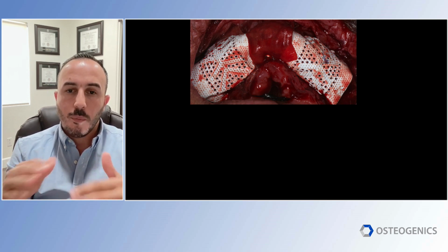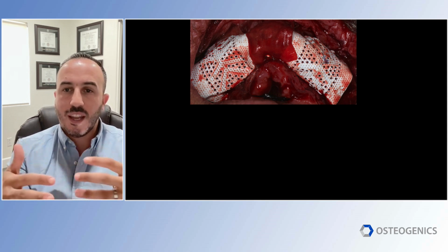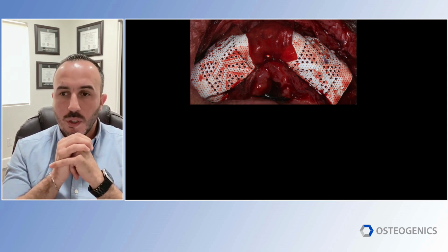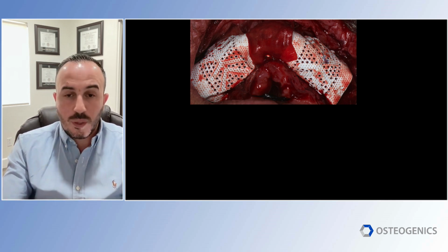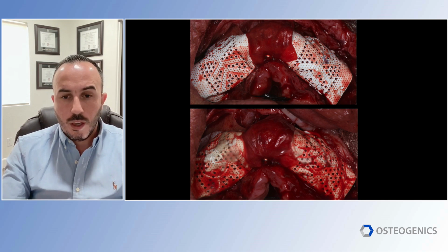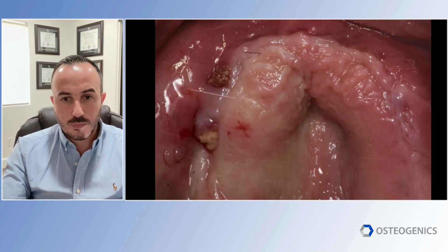It's not a problem. But there's part of the bone particles will have room to fly out. That's when I can add any non-cross-linked collagen membrane without any problem, because it's only for stability, not much for space maintenance. And we lay an amniochorion membrane on top of it, and we go for a tension-free primary closure using Cytoplast membrane sutures, and Glycolon sutures.